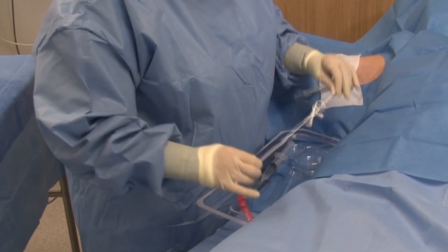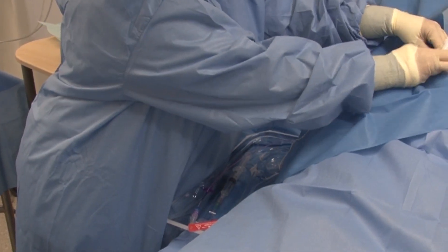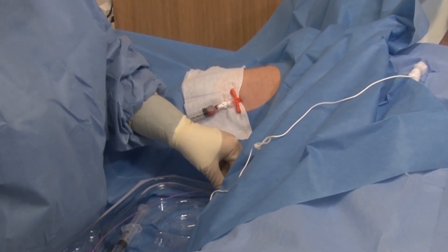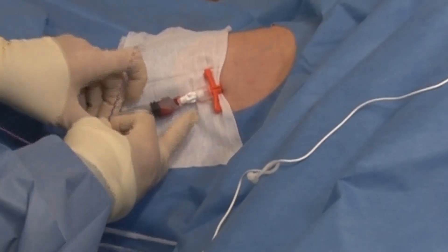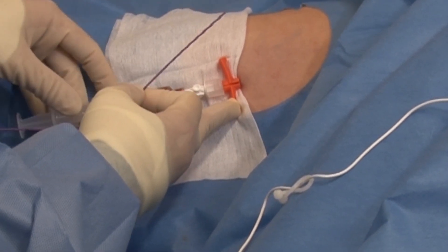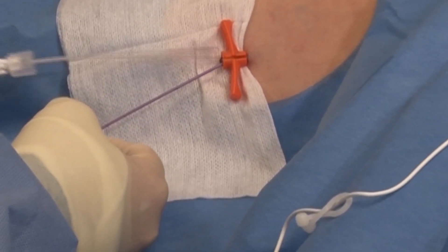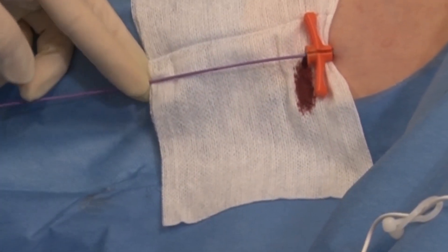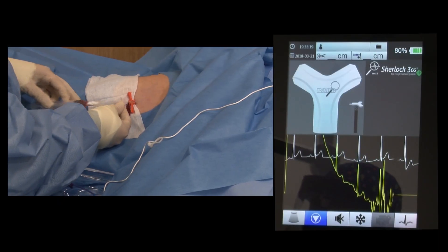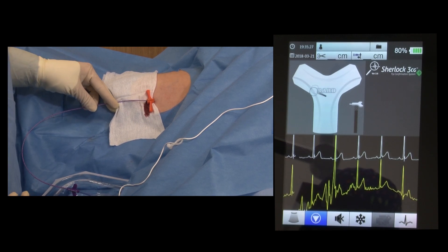Next, the PICC wire is attached to the chest plate by puncturing the sterile drape with an enclosed metal spike. This allows the system to detect the upcoming intravascular ECG. The inner part of the introducer should be removed prior to advancing the PICC a short way into the vessel. You should begin to see an intravascular ECG, seen here in yellow. This ECG is generated via an electrode on the end of the wire within the PICC.